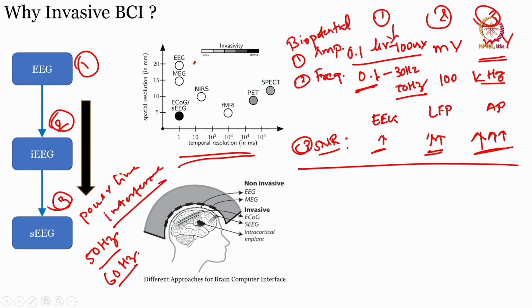Again, there are other things, like how much contact area is also one of the parameters, and along with contact area comes the field of view. If you ask a neurosurgeon, they will tell you what the actual view is, but these two things matter.